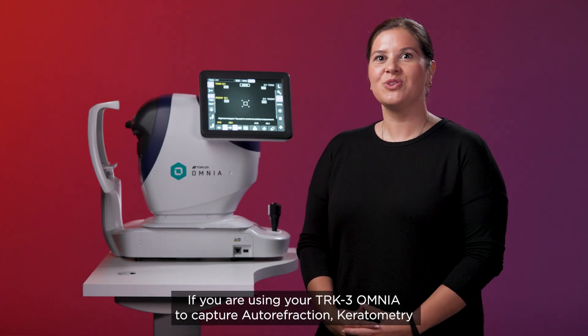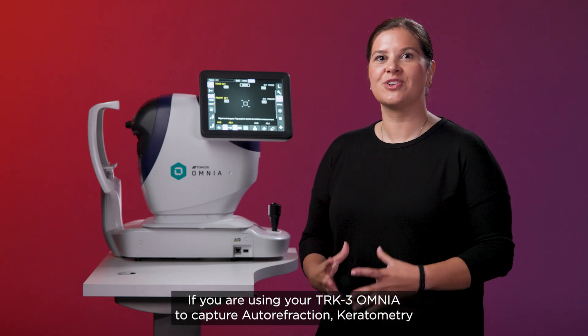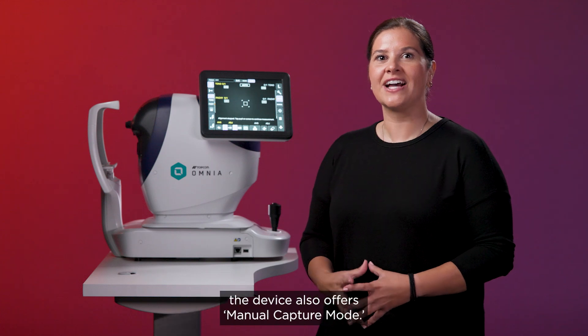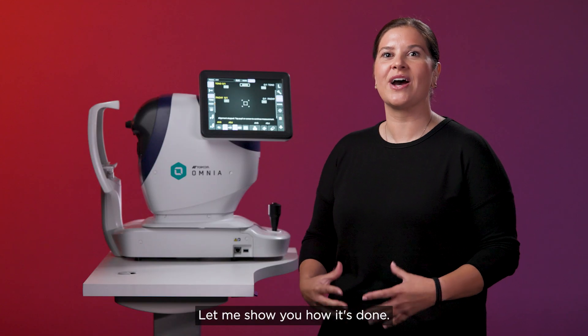Hi, I'm Mary from Topcon Healthcare University. If you are using your TRK3 Omnia to capture autorefraction, keratometry and tonometry on a patient where cooperation is an issue, the device also offers manual capture mode. Let me show you how it's done.